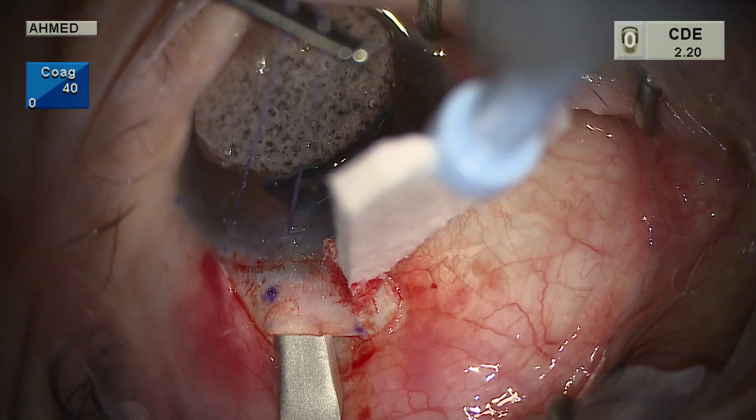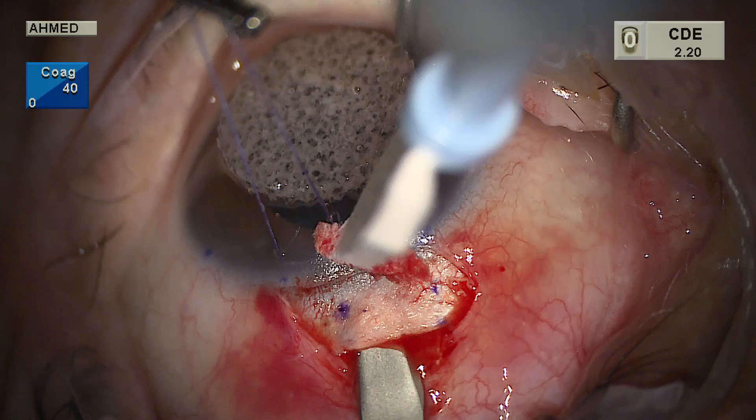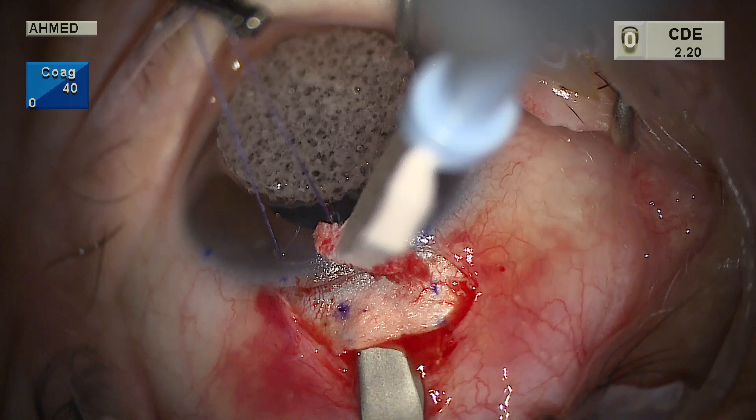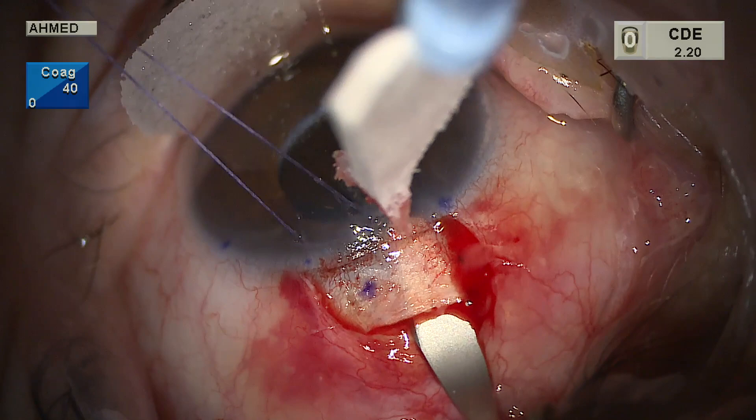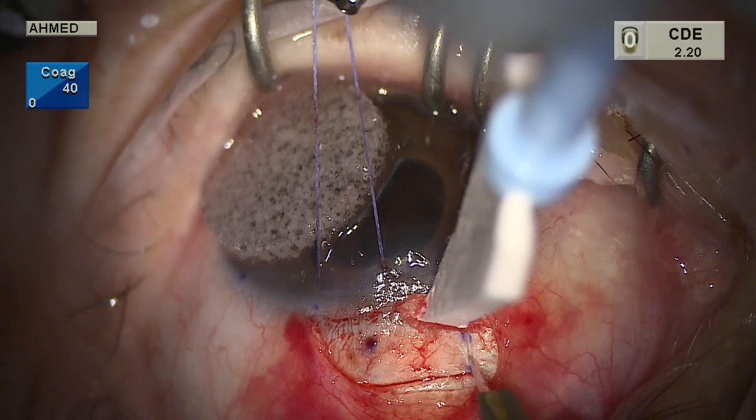The blade is swept left and right to the full width of the flap to create the 3.5 millimeter flap. Once at the end of the blue zone — where white meets blue at the corneoscleral posterior limbus — the tip of the blade is tilted more anteriorly, tip up and heel down. This adjusts for the change in globe curvature as we enter the cornea, preventing premature entry into the anterior chamber without lifting the blade itself.